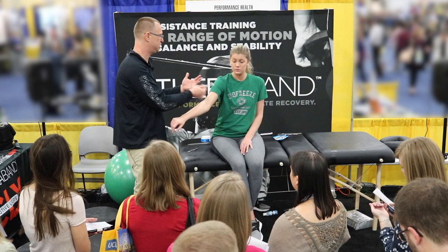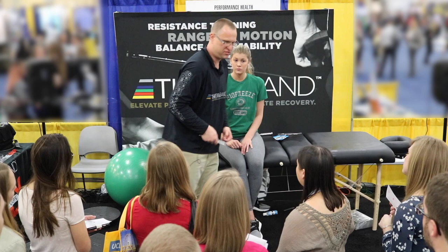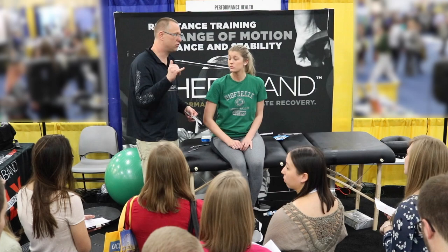To summarize the three theoretical frameworks: mechanical theory — feel tension, break it up; neurosensory — a therapist I know working in a skilled nursing home uses an instrument along the QL to facilitate afferent input for stroke patients rather than just walking them with a gait belt; and sensory-motor and fluid exchange from a pain control standpoint.